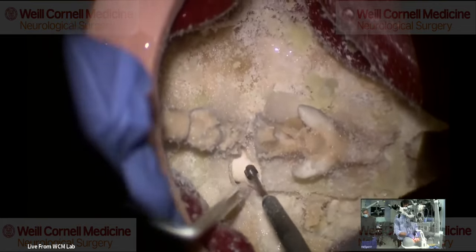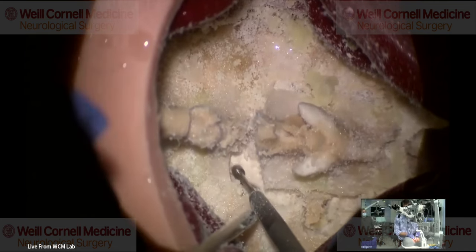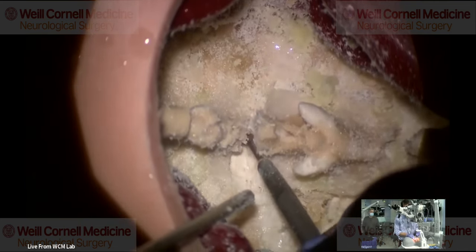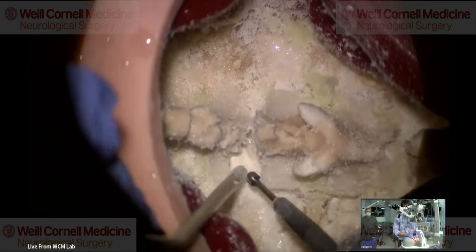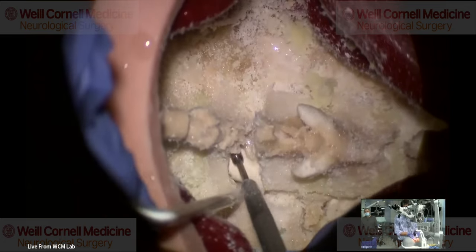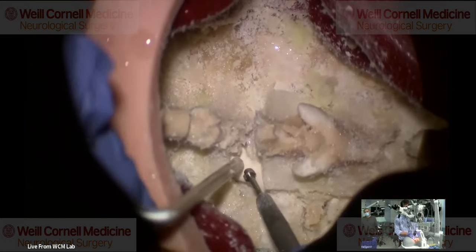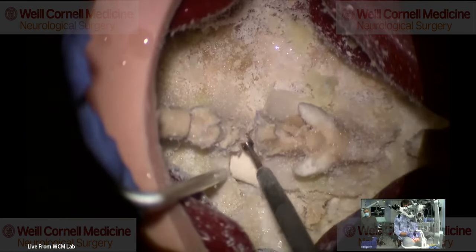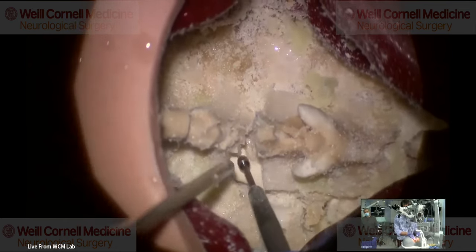Yeah, the first generation cephalosporin. And what do you do to prevent kinking at the top and the bottom? Sometimes it can, but that's why you want to make sure that you get all the levels that need to be done. Because sometimes you see this ballooning out like this, and you go, I'm not sure that's going to be enough. And then you sort of have to look at your MRI and decide, is it worth it?